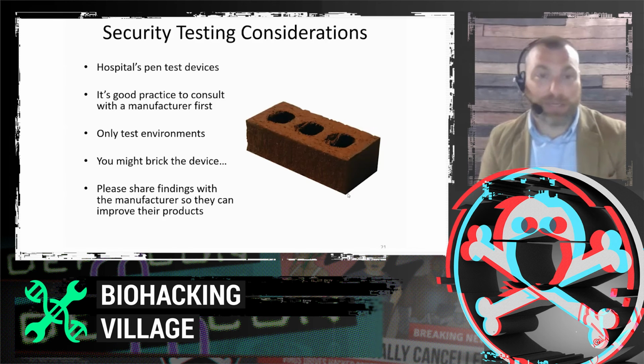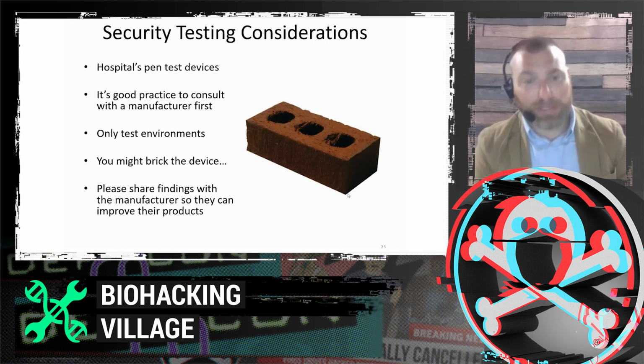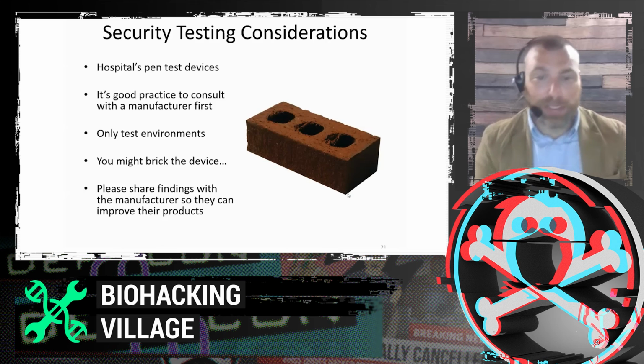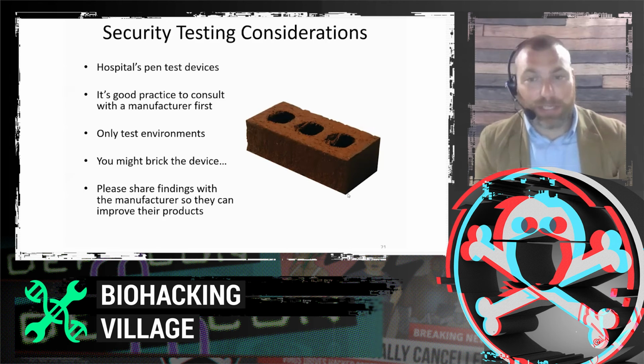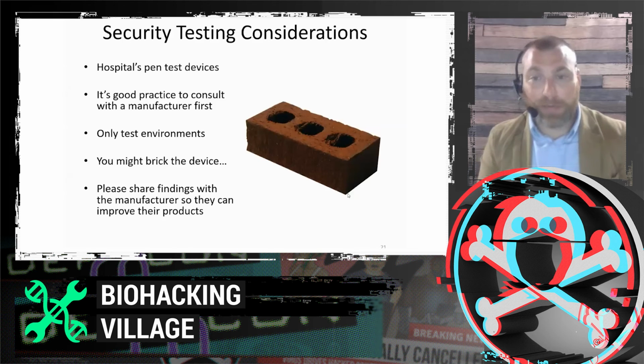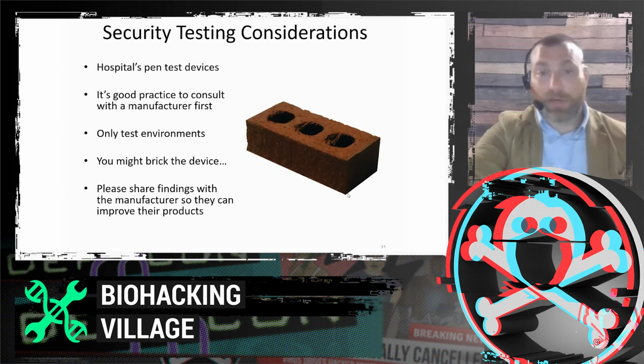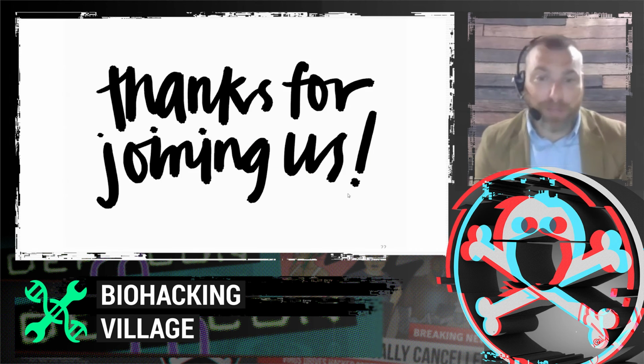As Helen said a few times, obviously you don't want to test in a live environment. You want to test in a test environment, and you need to be aware that there could be adverse reactions to pen testing, but certainly it is a good thing to do. Just have that open dialogue with the manufacturer so that you can have the best result of that pen test as possible, and share the findings too. Certainly medical device manufacturers want to know if there are any issues that they could potentially fix. So thanks. That is the class.